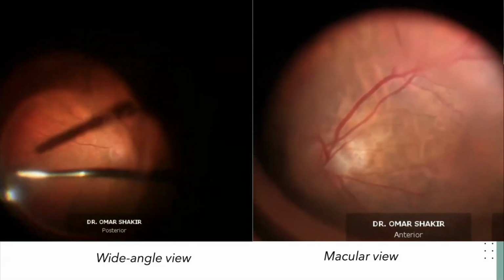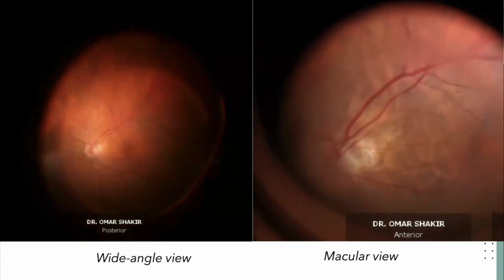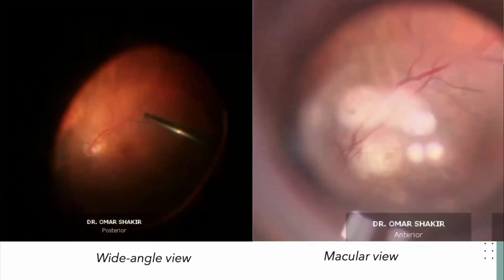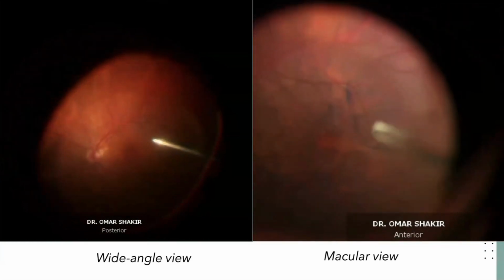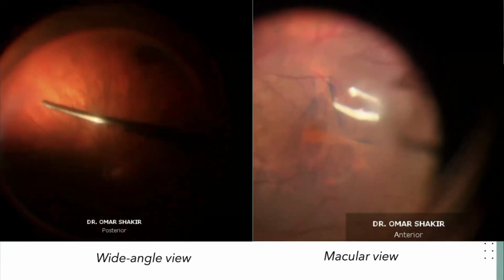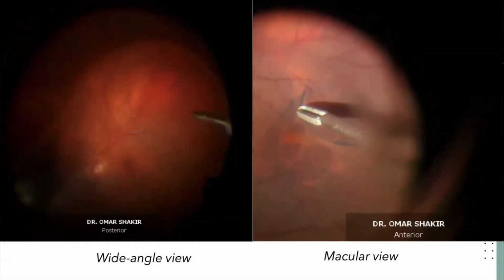And if I am correct, I believe this is the same patient. I think I put the same patient here to illustrate the example, but you can see here, there's way more zoomed in view, way more detail on the right, which is great.